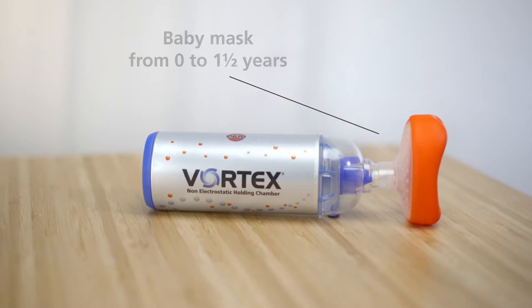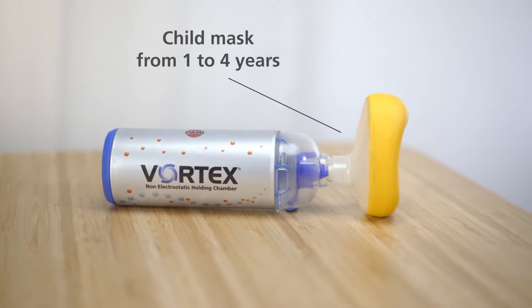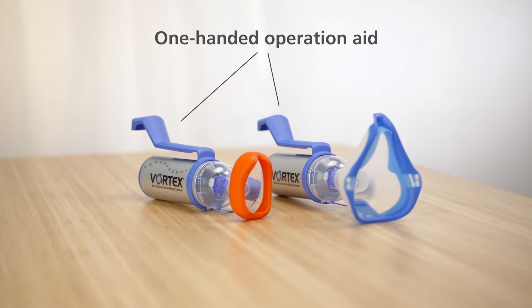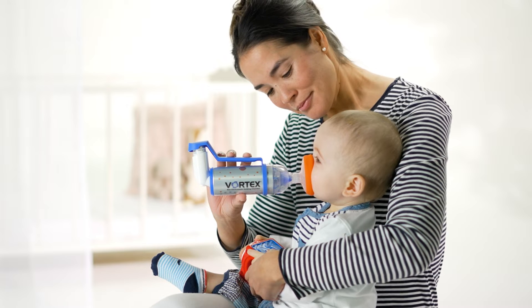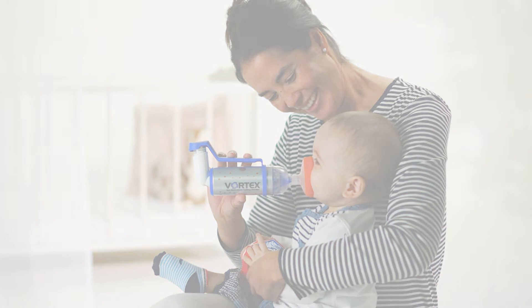A baby mask from newborn to one and a half years, a children's mask from age one to four years, and an adult mask. The patented one-handed operation aid makes inhalation with babies easier and can be operated with just one hand. It also supports patients with poor strength in their fingers or coordination problems.